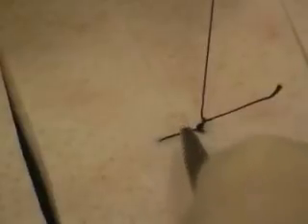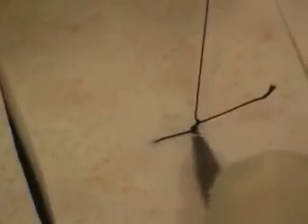At the very end, we're going to pull the whole thing over to one side. It's already kind of on this side, so we'll put it over there. The reason being, we want the knot to be not above the laceration, because seepage and everything can actually get into that knot and cause trouble. So if you pull it over to the side, this is where we're going to put all of our knots on one side.